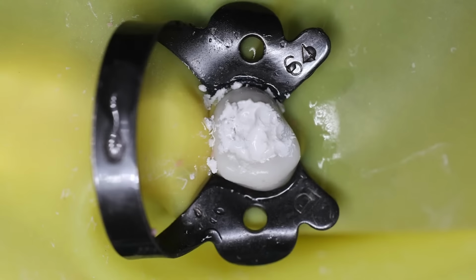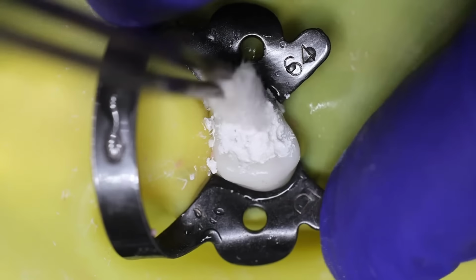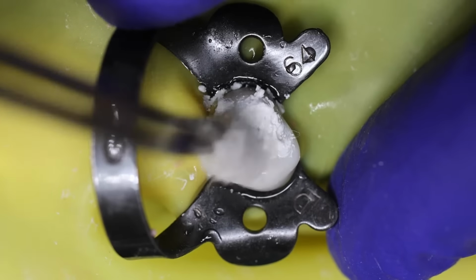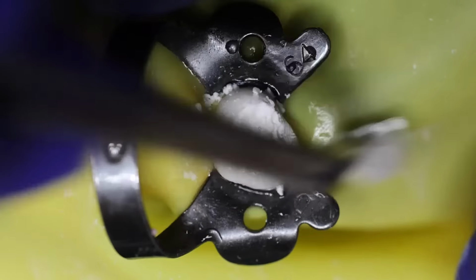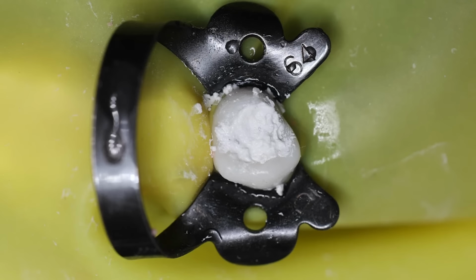Then you can use a slight cotton to condense it. Remove any excess that is there.